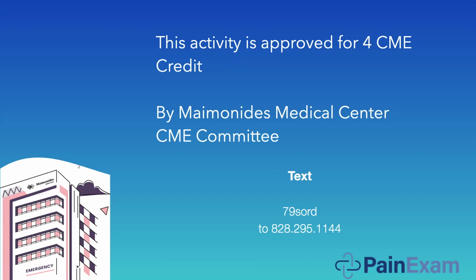There's another question: how long to use PRP after I do a diagnostic block? That's an interesting question. Well, you don't need a diagnostic block for PRP. If it's RFA you're referring to, well, you just need to have a follow-up or at least a document in between the block, documenting response, and then afterwards you can do the lesioning.